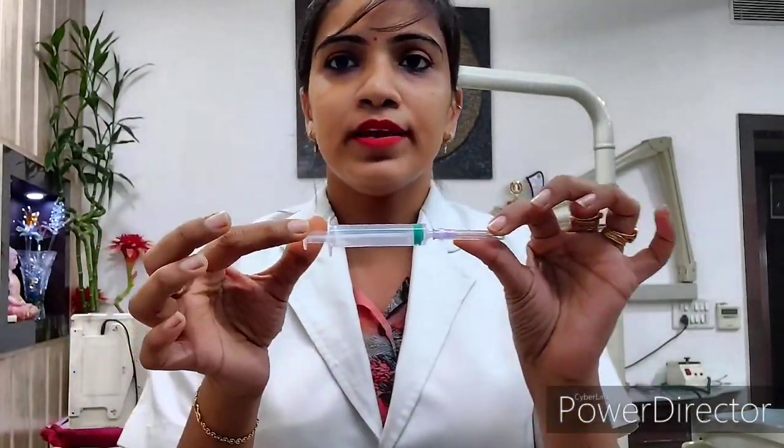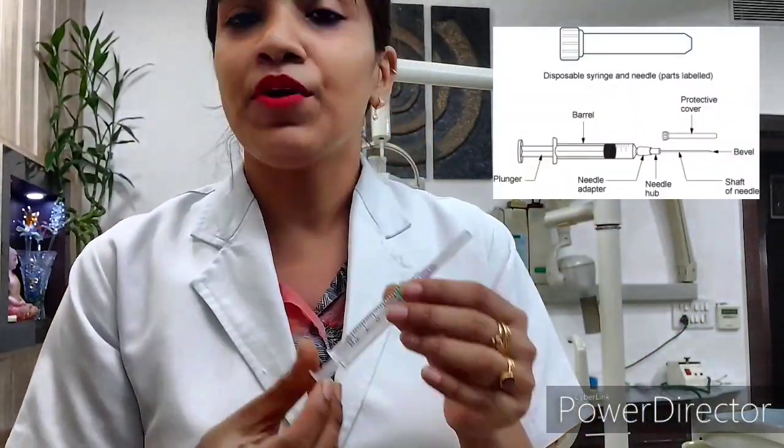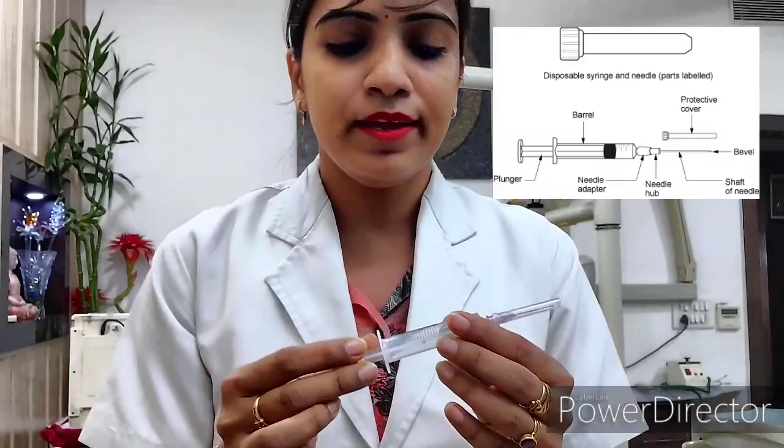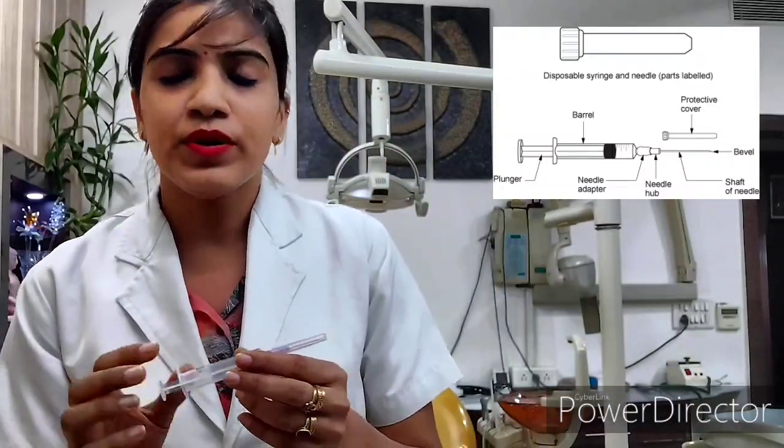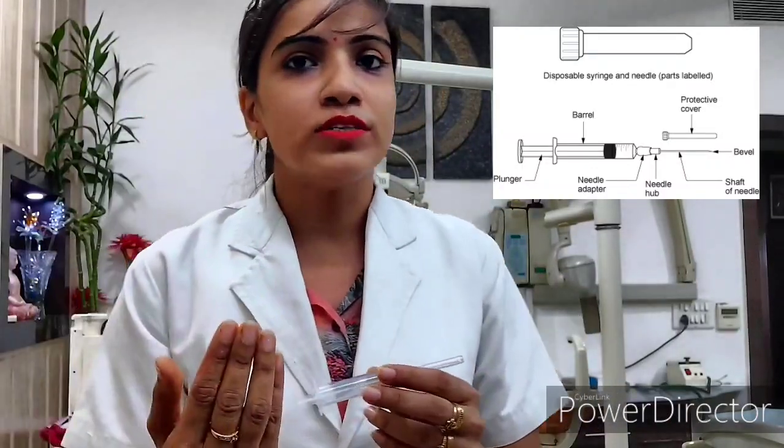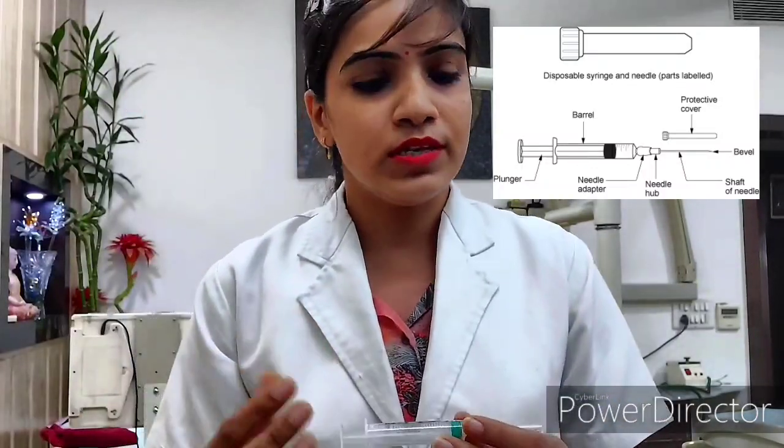So I am having a syringe — this is one, and this is another. So this is called a dental syringe. I am going to tell you about all syringes. This is our normal syringe, and this is a 5ml. But it depends on the quantity that you need.